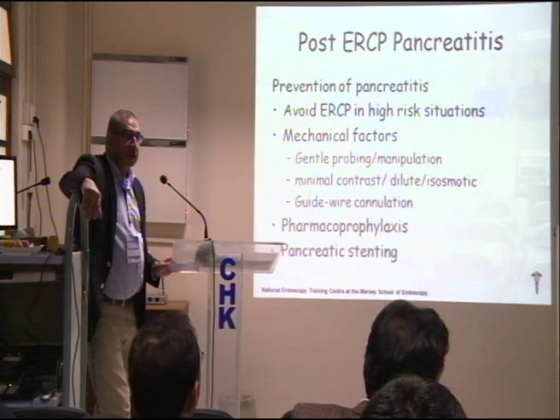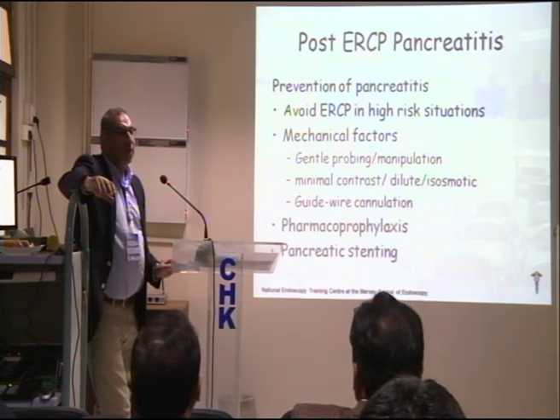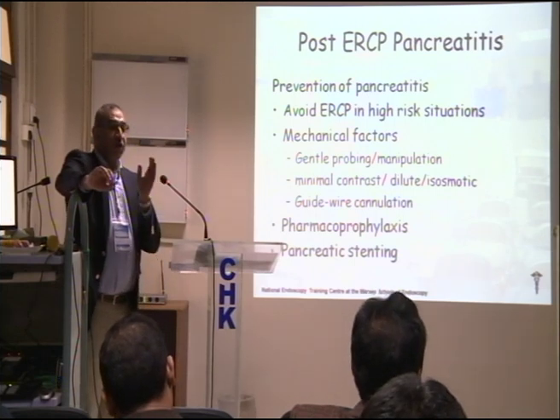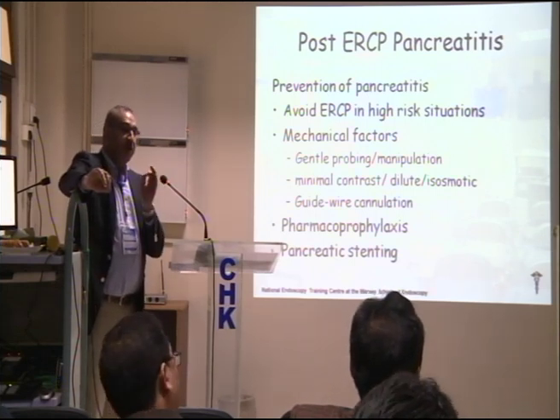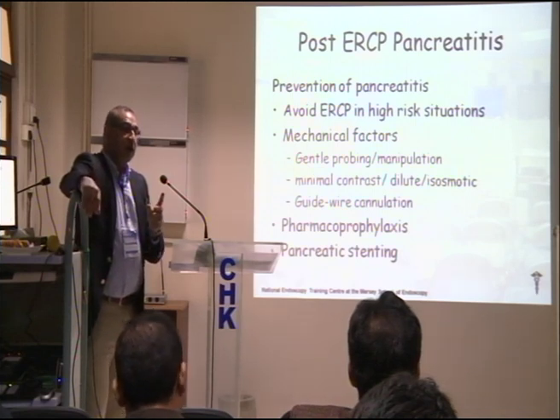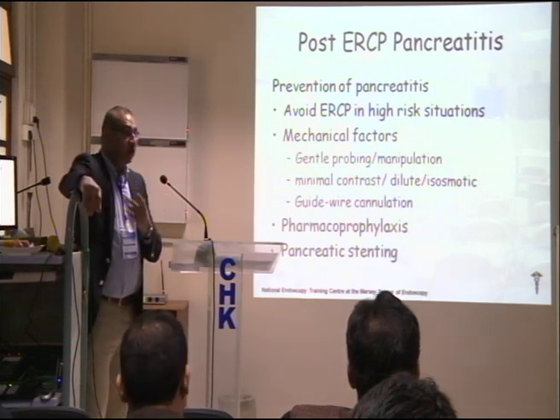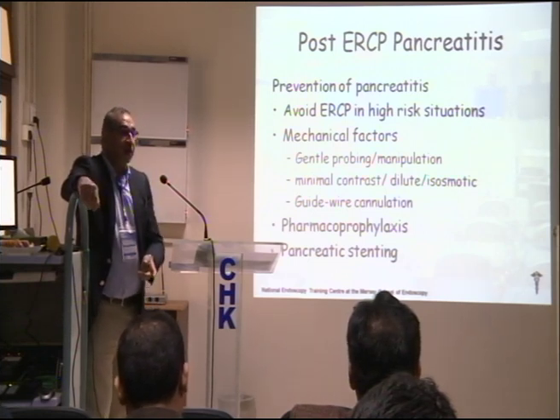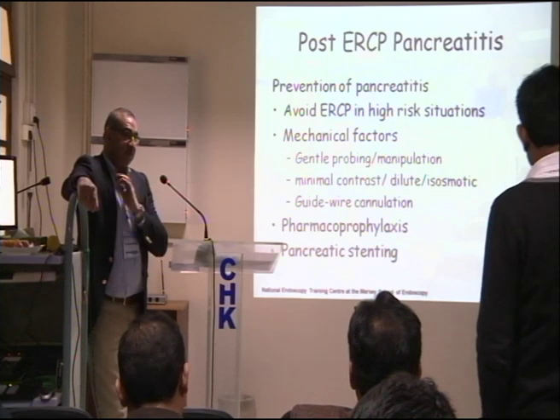Wire-guided cannulation, you don't need pancreatic stents. Normally, I feel that I've not caused any trauma, because first of all, your cannulation should be very gentle. Wire-guided may be extremely gentle, because it's a very soft procedure. It's just like playing golf. When you do the swing, you don't hit the ball by putting all your power into it. It's your rhythm, it's your touch which matters, not how much power you use or how rough you are.